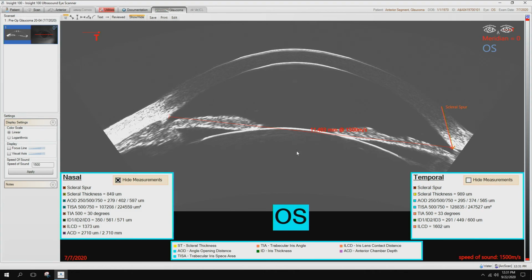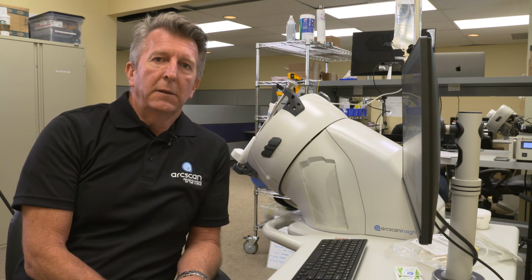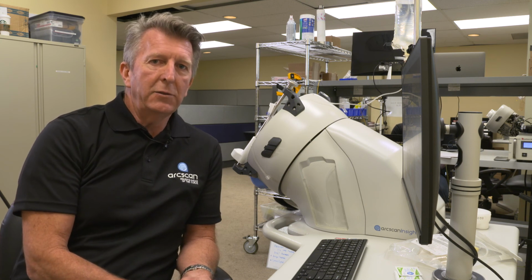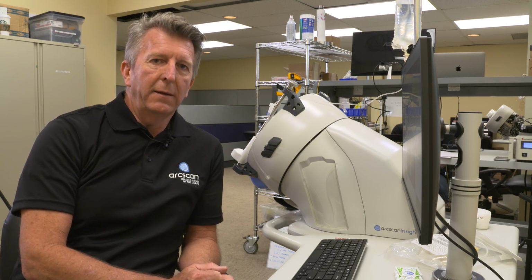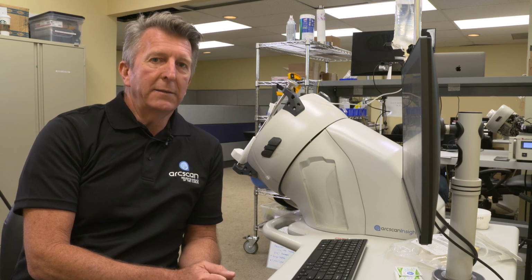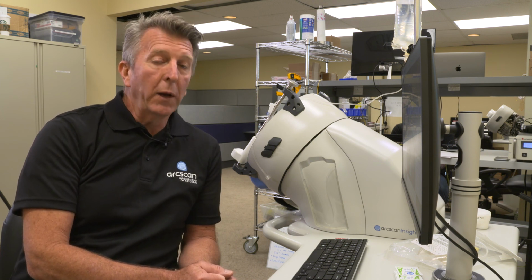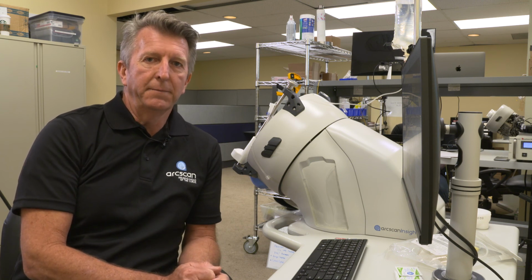Of important note, with the glaucoma, we do have a reimbursement code here in the United States, 76513. There is a multitude of individual ICD-10 codes for various pathologies. Obviously, anytime it's medically necessary, you can go ahead and bill for that. The average billing is $180 bilateral. That's a far better reimbursement than an OCT image. So from this standpoint, if you're financing the equipment, it's a quick ROI utilizing that reimbursement code 76513.